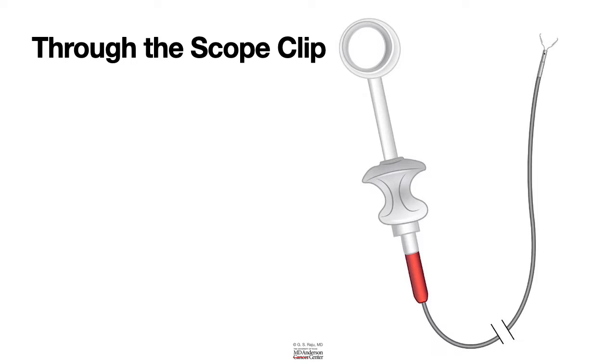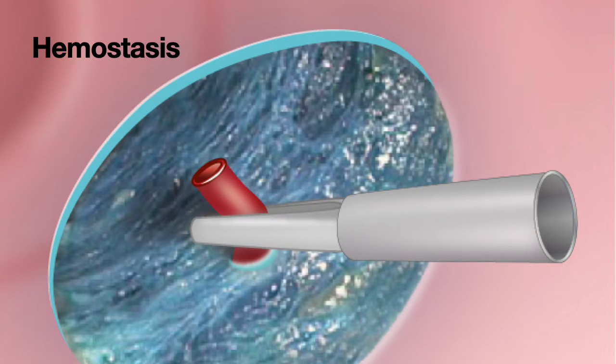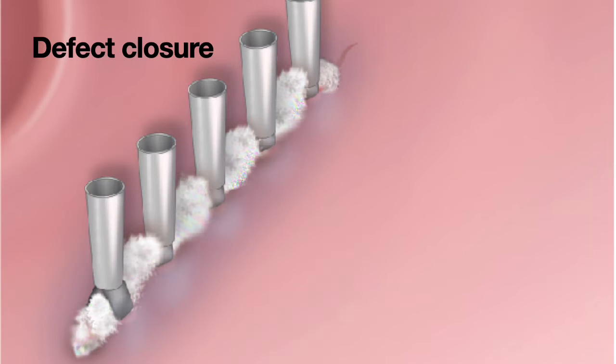They are most frequently used to control bleeding, otherwise known as hemostasis, and after resection of large polyps to close the defects and also close perforations.